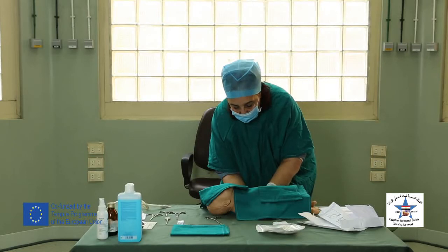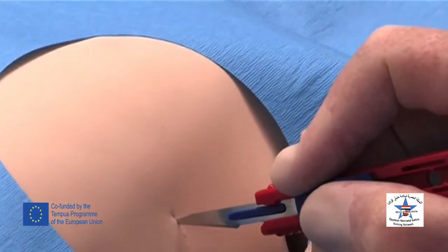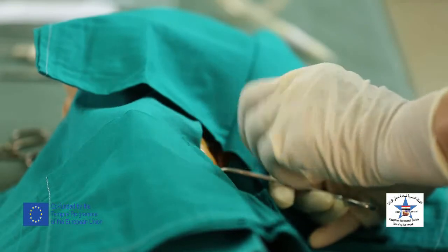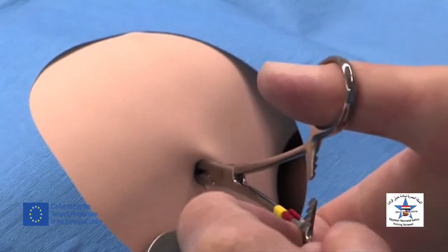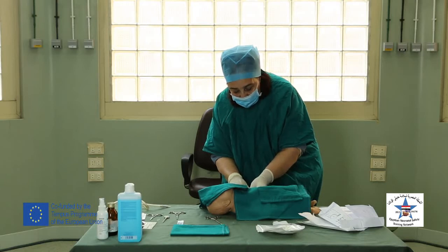I will make a longitudinal incision along the fourth rib, 0.5 centimeters in length in the skin. And then with the curved forceps, I will enter this incision through the skin, and by an opening and closing movement of the curved forceps, I will push into the subcutaneous tissue and intercostal muscles until I reach the resistance, and this is the parietal pleura.